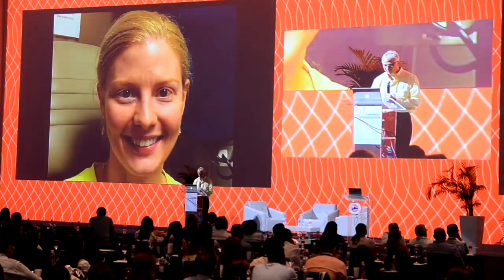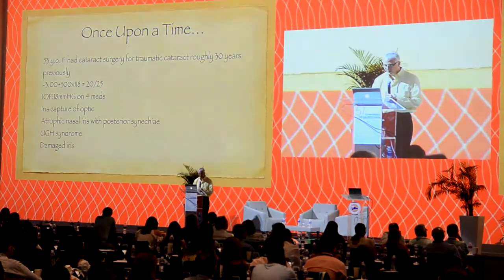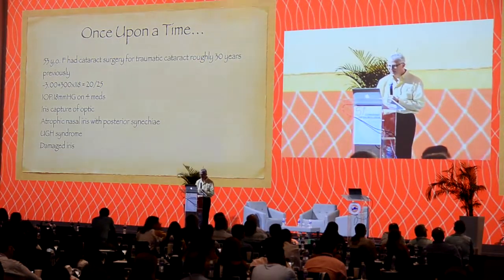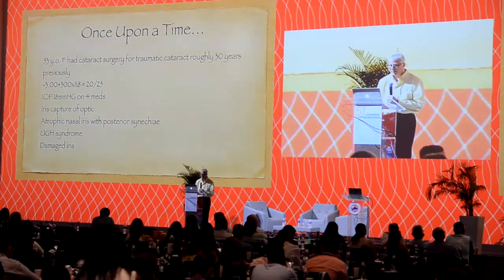This is what she looks like post-operatively. Zoomed in, happy patient, 2020, no light sensitivity. Briefly, we'll run through one last case. Here's a 53-year-old lady, had cataract surgery for traumatic cataract 30 years ago at the age of 23.